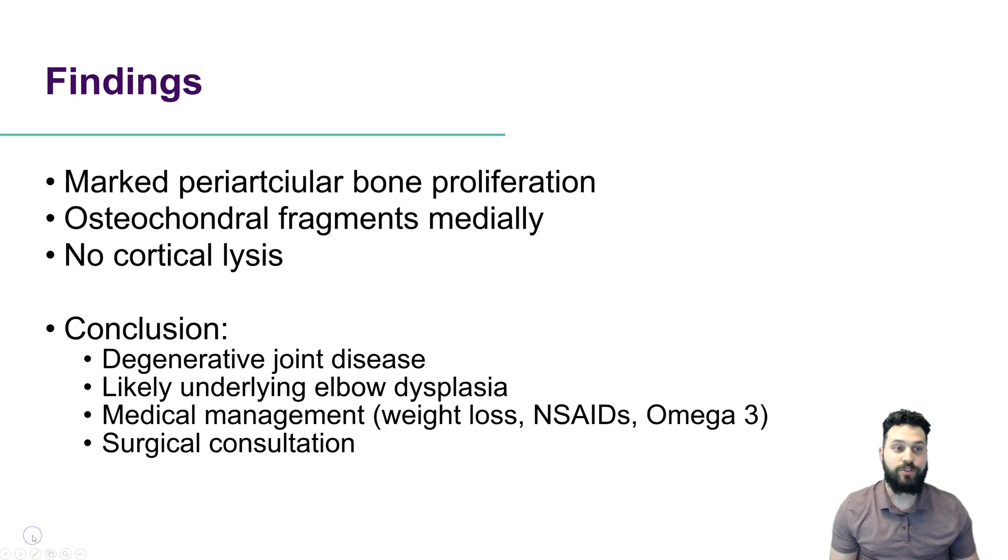Our findings in this case were marked periarticular bone proliferation, including osteofragments medially and at the level of the medial epicondyle, which indicates some degree of flexor enthesopathy. There was no cortical lysis, so no evidence of an aggressive joint-associated lesion. The conclusion is degenerative joint disease or osteoarthrosis, with likely underlying elbow dysplasia.